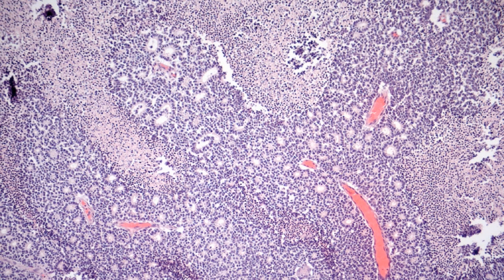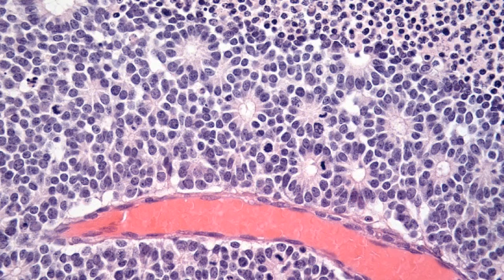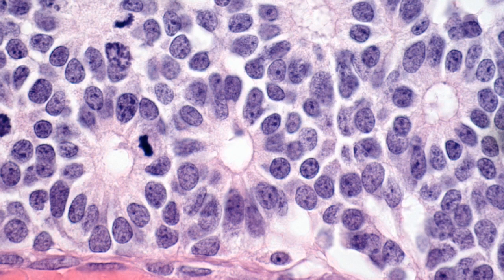The microscopic sections are used to diagnose eye diseases like this pediatric malignant retinal tumor, retinoblastoma. This retinoblastoma contains numerous circular structures called Flexner-Wintersteiner rosettes, which are seen under higher magnification in the next photo. Examination of microscopic sections also can guide therapy. The retrolaminar invasion of the optic nerve seen in this eye with retinoblastoma is an indication for additional chemotherapy.